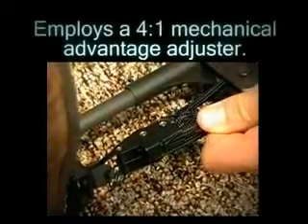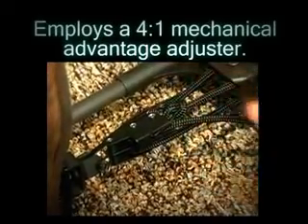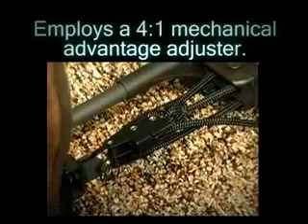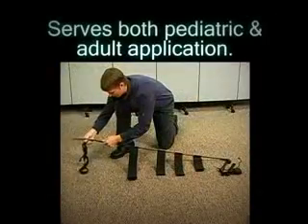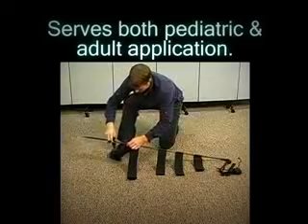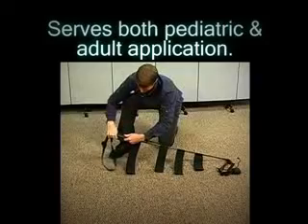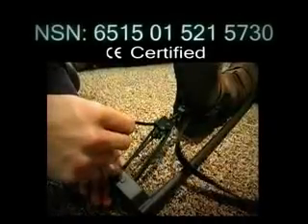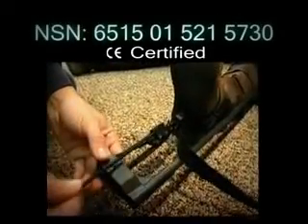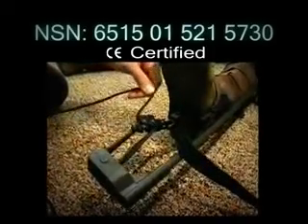The traction adjustment system employs a 4 to 1 mechanical advantage adjuster that gives ample pulling power in precise increments. Economical both in dollars and space savings in that it serves both pediatric and adult application with one unit. There are many other advantages that will be covered later in the presentation. The CT-6 is currently in use by civilians and armed forces around the globe and carries a national stock number.